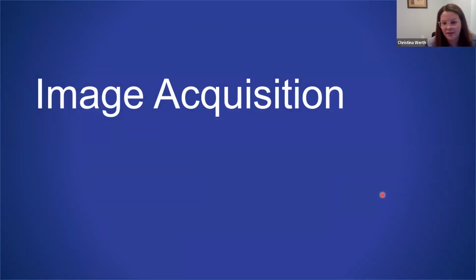So now that that demonstrates how important this view can be, I just want to quickly run through the image acquisition and the technical aspects of these views.